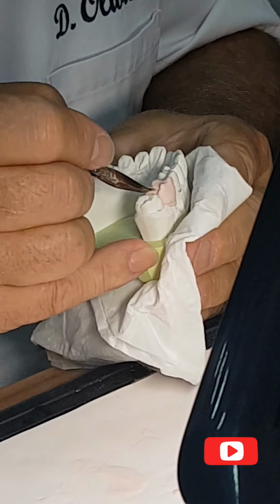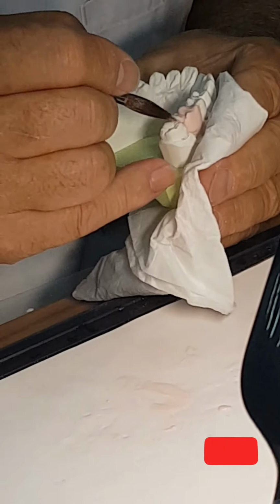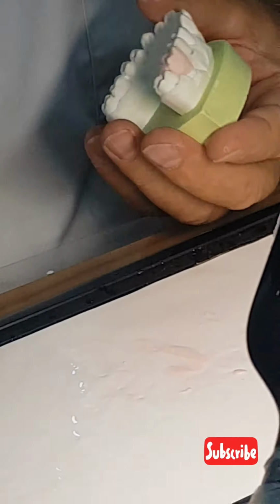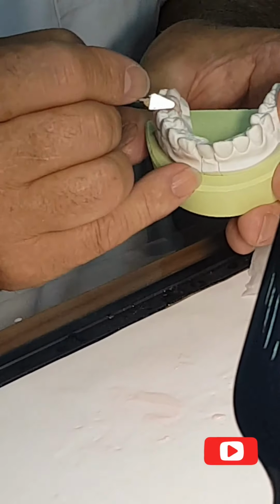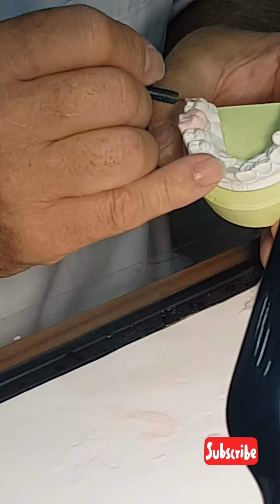Here, I start to give a little more details. Now, up. And I continue to work very clean. One cast, another one, that one, that one.